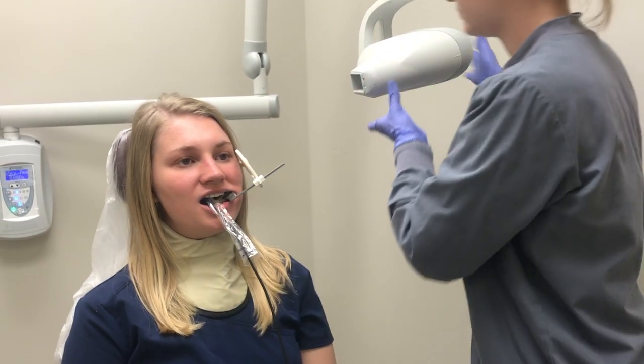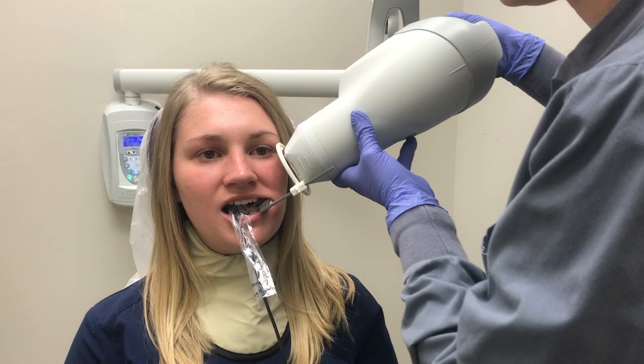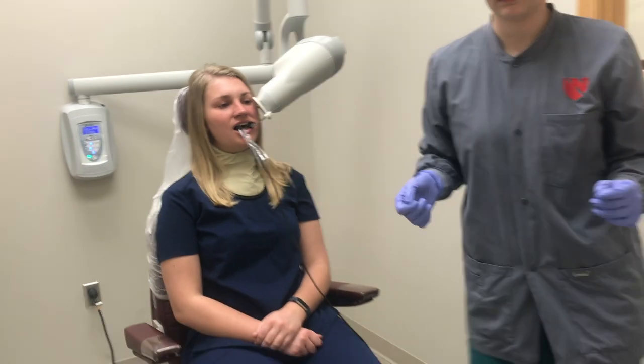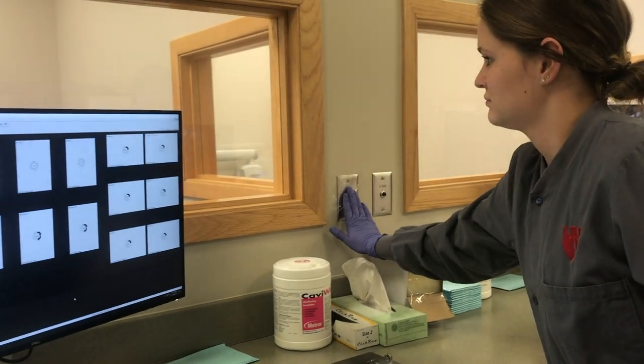Slide the ring closer to the patient's cheek. The tube head should be parallel with the indicator arm. Make sure the rectangular collimator is horizontally aligned with the position indicating device. Press the exposure button until the beep is no longer heard.